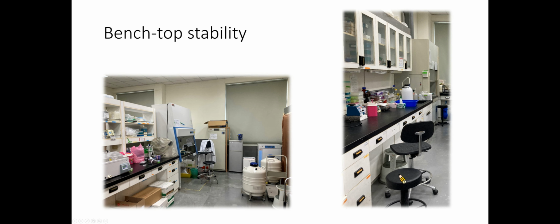The benchtop stability is the stability of an analyte in the matrix under conditions of sample handling during the sample processing. You should determine the stability of samples under the laboratory handling conditions that are expected for the study samples. For example, the stability of samples maintained at room temperature or stored in an ice bucket.